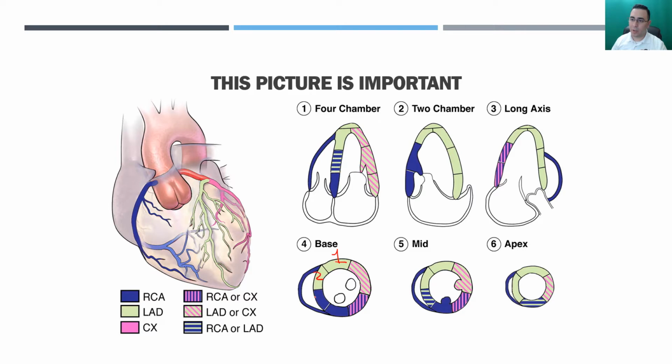This is segment number 2. This is 3. This is 4, 5, and 6. And if you notice the pattern, I'm just going counterclockwise, all right? Therefore, this one right here has to be 7, this one 8, 9, 10, 11, and 12, right? And this one is 13, 14, 15, and 16. So we have the 16 segments in here. Now we have to place those numbers up here depending on the names.